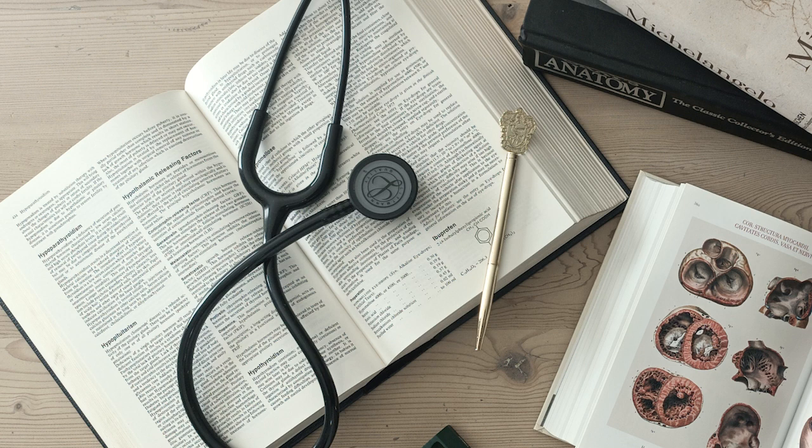Exactly. And finally, ventricular fibrillation is characterized by very large, extremely irregular waves, where any organized electrical activity, and thus any differentiation between atrial and ventricular electrical events, is completely lost. It's just chaotic, uncoordinated electrical activity, a terrifying scribble on the screen, life-threatening. Okay, that's a clear breakdown.